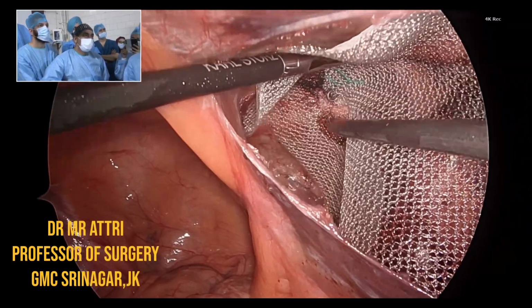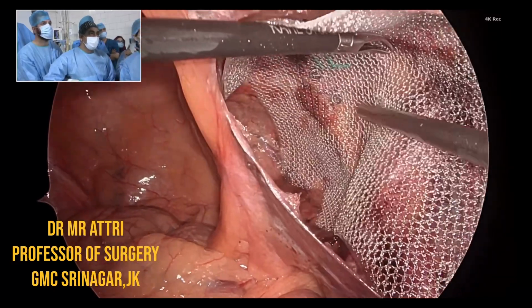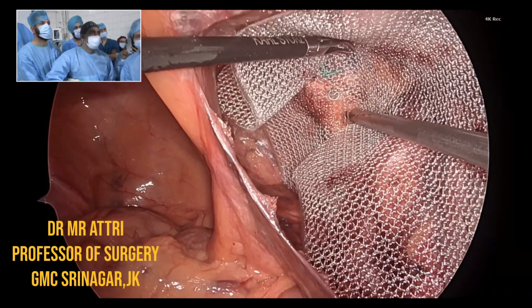Since there was a vessel, I'll apply one more tacker. Since I'm not very sure, we have to see this tacker. I'll apply one more. Should I? Very good, sir. Dr. Atri, yes, sir.